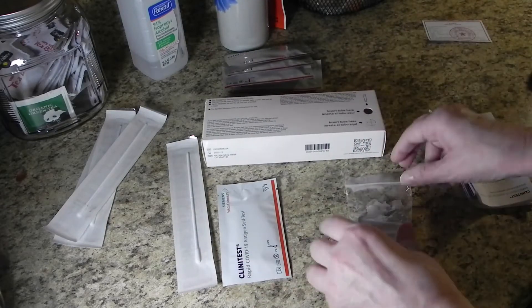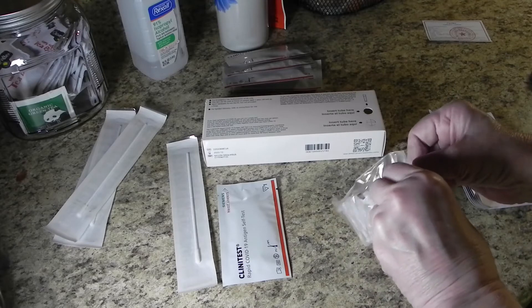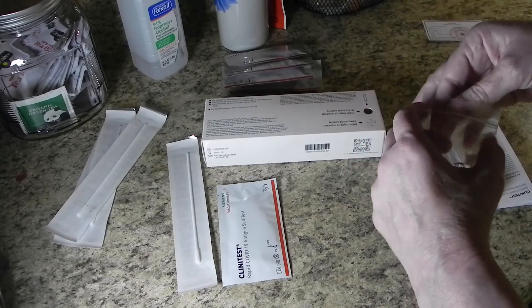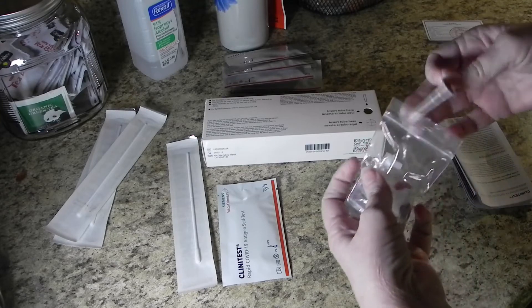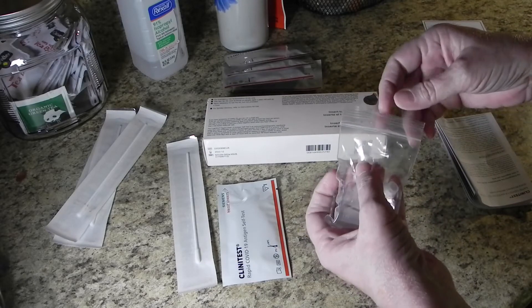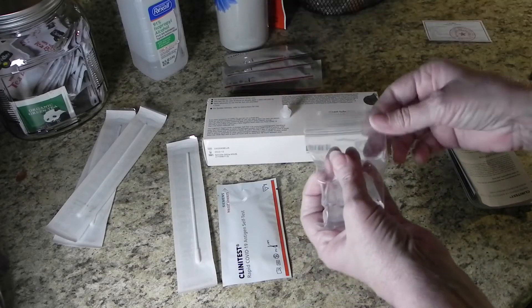Now take out a tube and a cap from the plastic bag. Be sure not to touch the top of the cap.